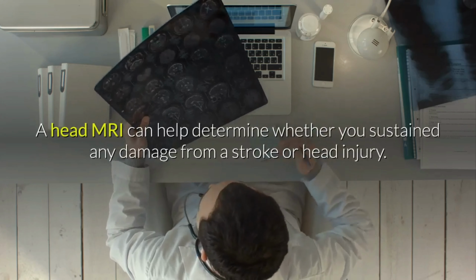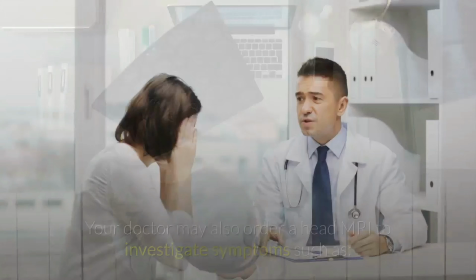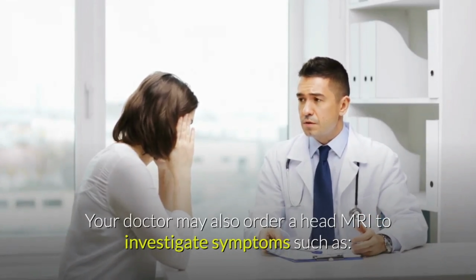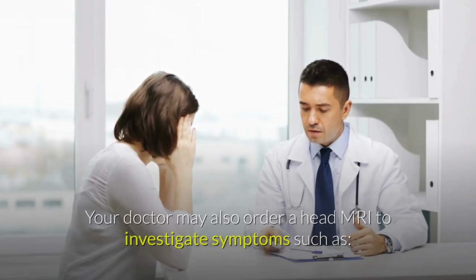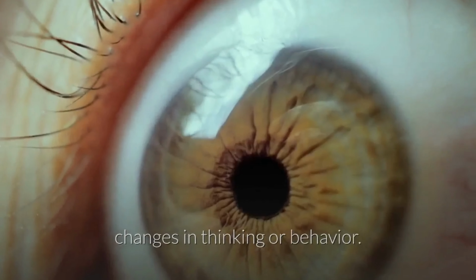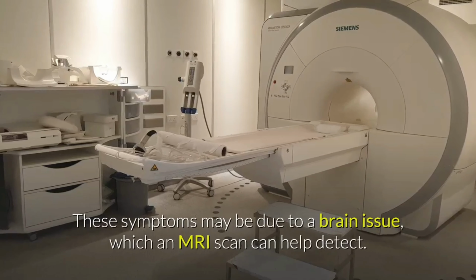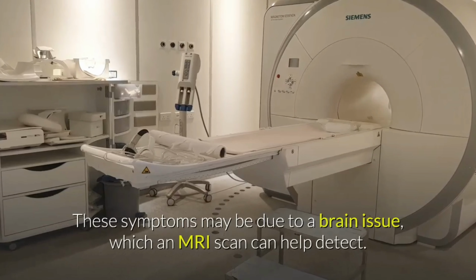A head MRI can help determine whether you sustained any damage from a stroke or head injury. Your doctor may also order a head MRI to investigate symptoms such as dizziness, weakness, seizures, changes in thinking or behavior, blurry vision, chronic headaches. These symptoms may be due to a brain issue, which an MRI scan can help detect.